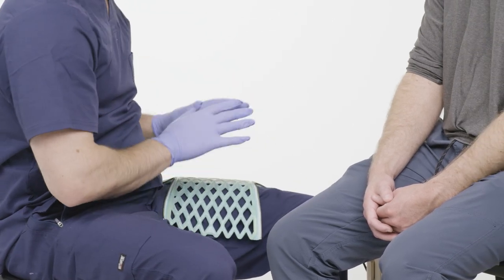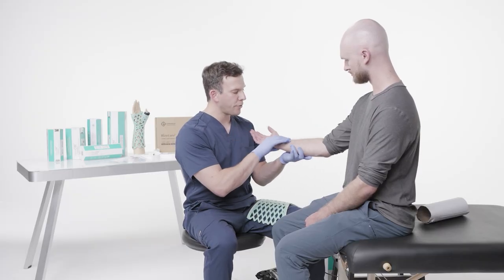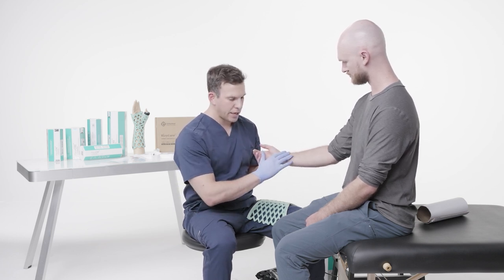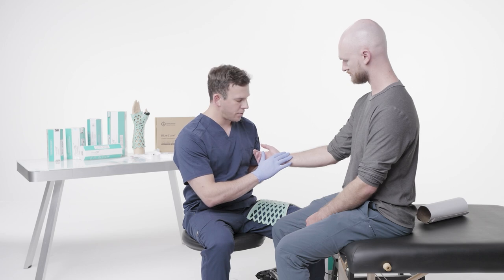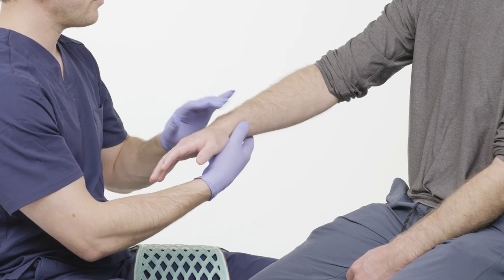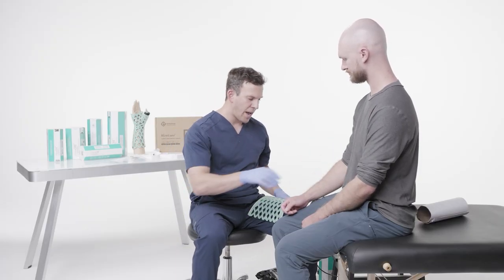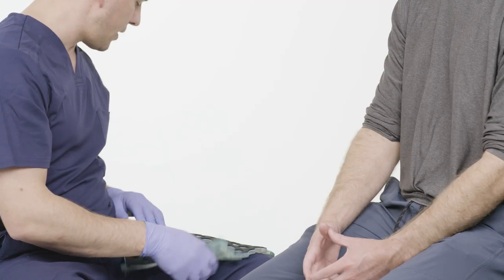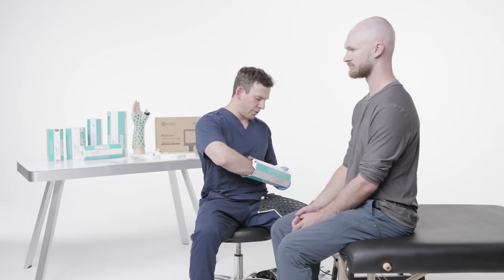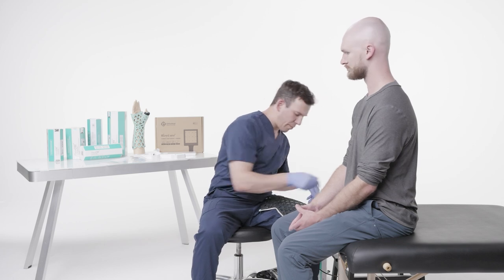Before I put the brace on the patient, I want to inspect the patient themselves. I want to make sure there are no open wounds, no infections, no abrasions. Check pulses, check dermatitis, check bilaterally as well. Then do a cap refill. He is neurovascularly intact distally. Also in the box, there is a Velcro strap that will help secure the thumb when I put the brace on.